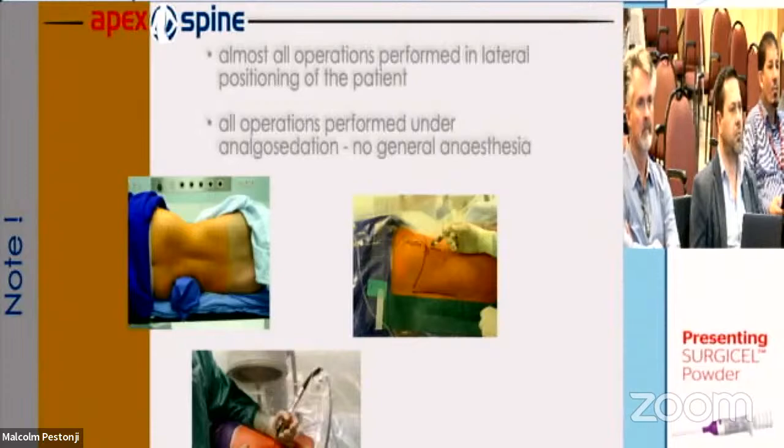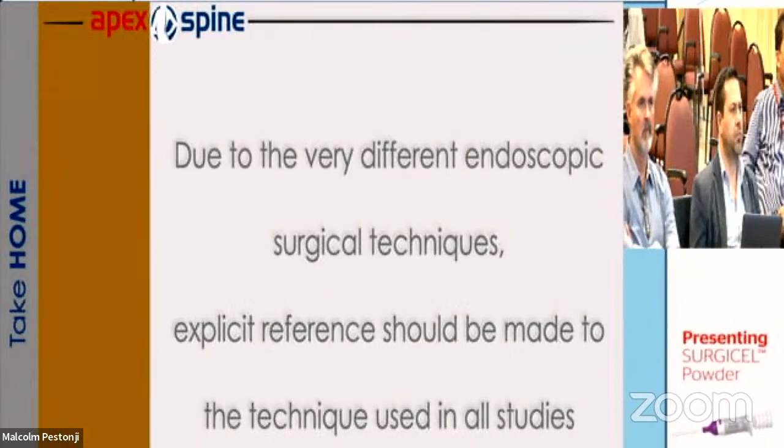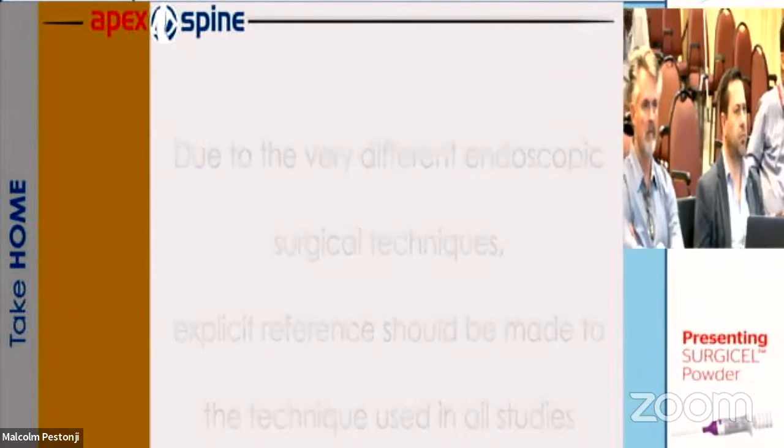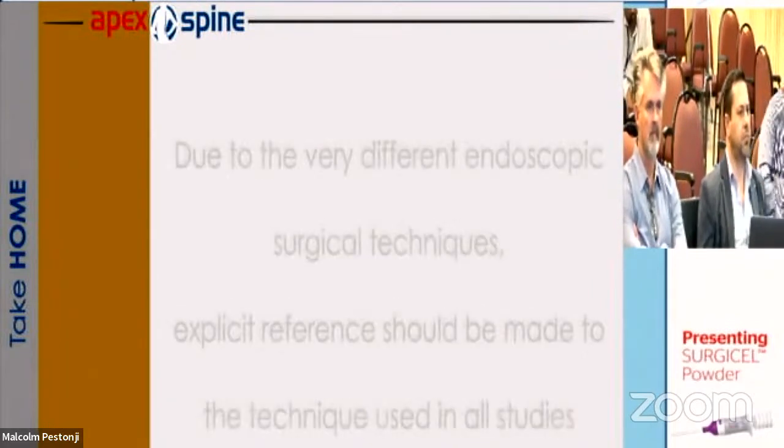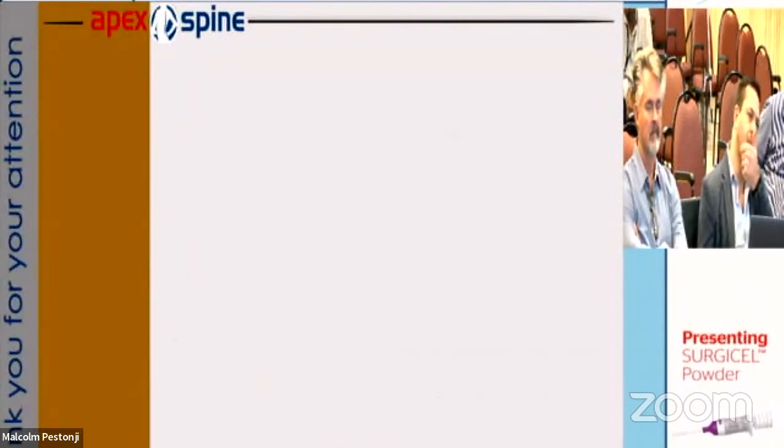So note, almost all operations were performed in lateral position of the patient, all operations performed under analgosedation and no general anesthesia. That means the transforaminal endoscopic spine surgery is an effective and safe procedure without significant complications and may help to avoid major operations or open microdiscectomies, independent of size or location of the herniated disc, and foraminal stenosis as well. In our center, it is the gold standard treatment. Take home: due to the very different endoscopic surgical techniques, like I have explained in the beginning, explicit reference should be made in the future to the technique used in all the studies.